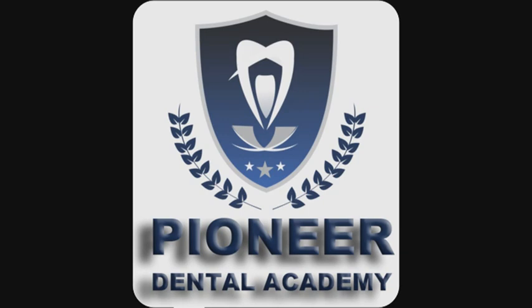You know how the penny test is done. You place a penny on your film and keep it on the safe light for about 2 to 3 minutes, and then you develop that film. If it's going to have a shadow like that, then it means improper safe lighting, and if there is no shadow and the film is clear, then it is proper safe lighting. Okay.